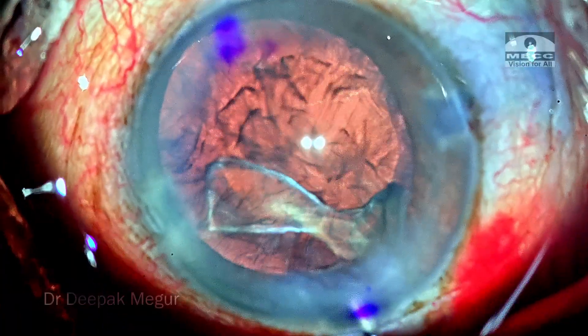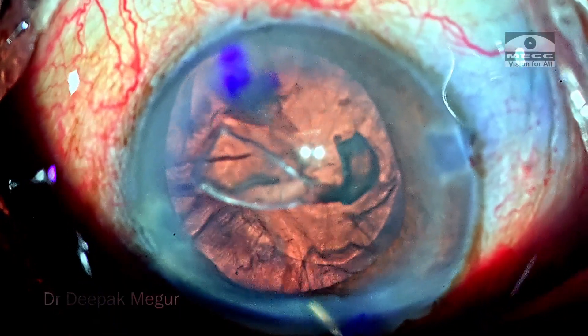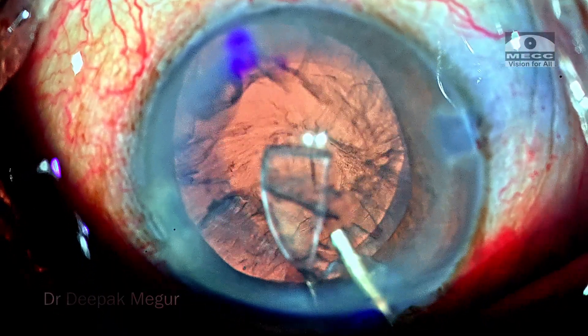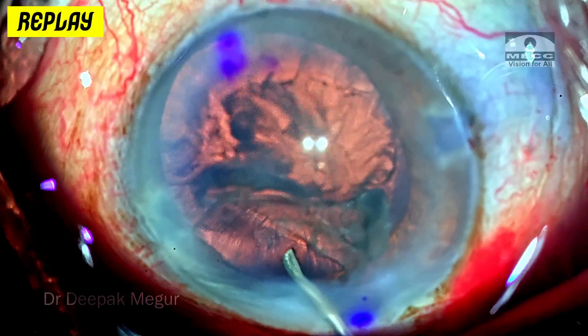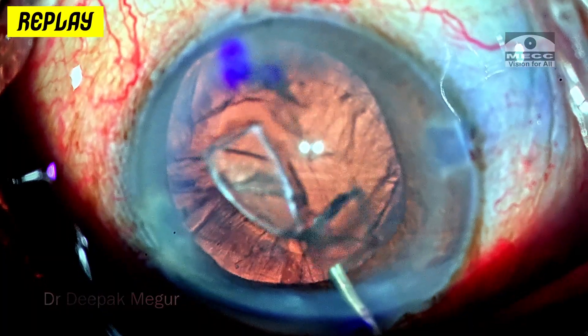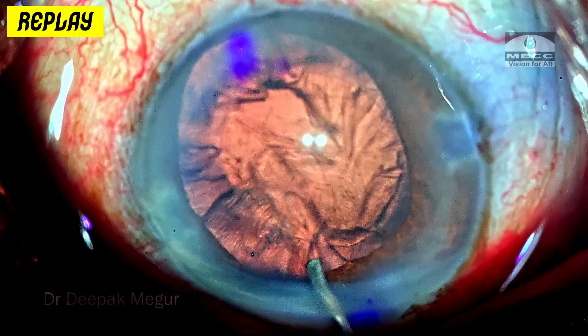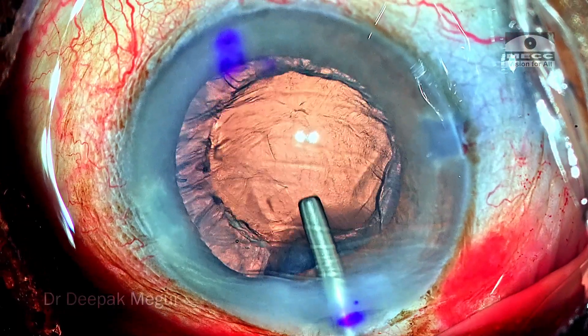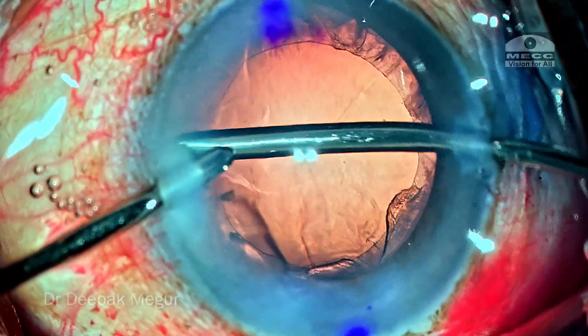We have just a little bit of epinucleus and cortex remaining. A small epinuclear fragment floating around is burped out using BSS — by burping out, I mean that when injecting BSS into the eye, I press down on the posterior lip of the incision. This ensures the loose lens matter flows out along with the BSS as I open the tunnel. Time to aspirate the cortex.